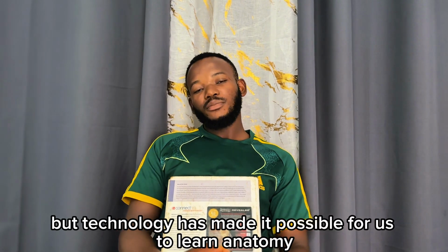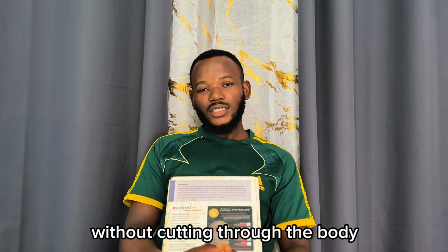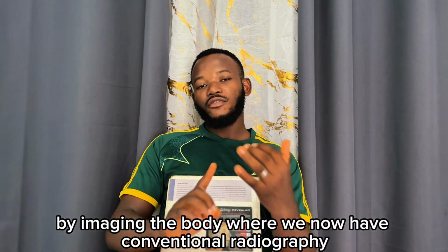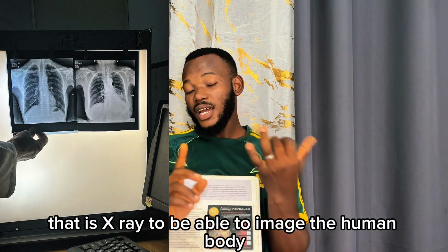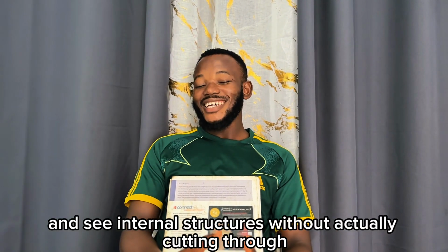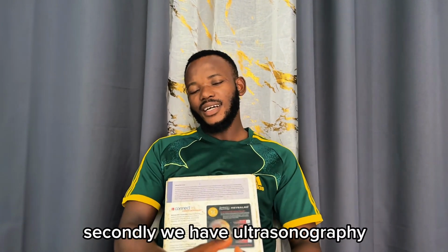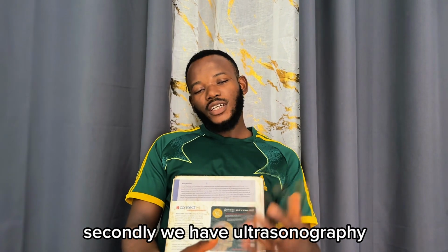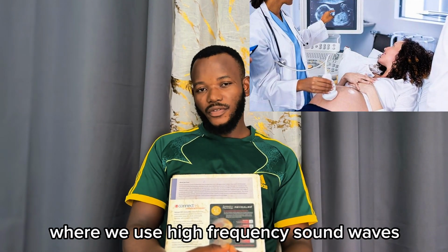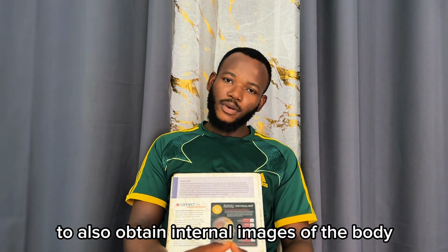But technology has made it possible for us to learn anatomy without cutting through the body by imaging the body, where we now have conventional radiography, that is X-ray, to be able to image the human body and see internal structures without actually cutting through. Secondly, we have ultrasonography, where we use high-frequency sound waves to also obtain internal images of the body.